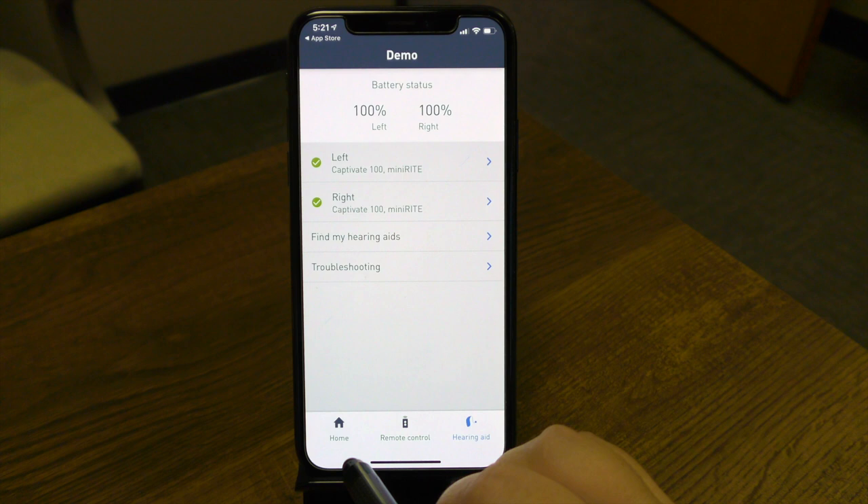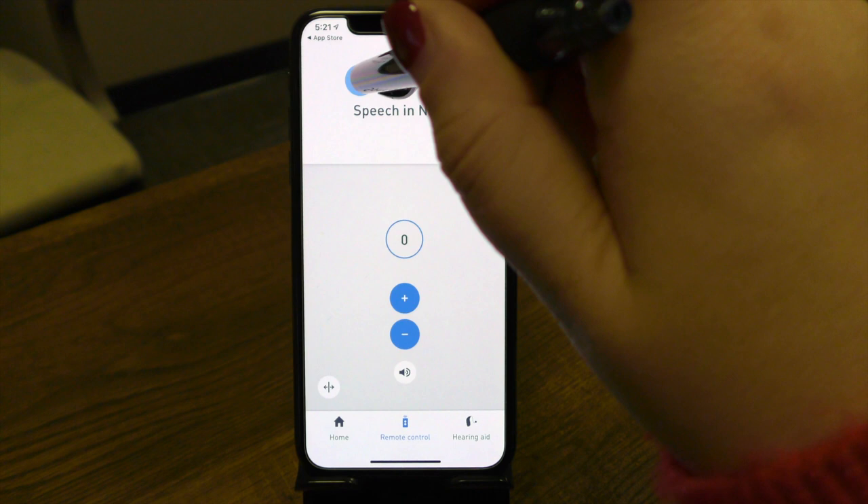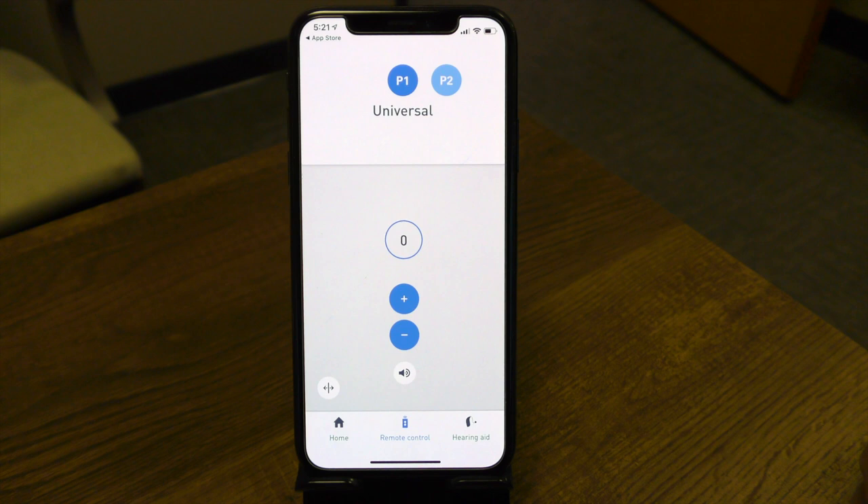To get back to your main dashboard, you can hit the home button, but I'm going to go back to the remote control — again, because this is where we'll spend the majority of time making changes if needed. I'll come back to my first program since it's more designed for an everyday situation, hence why it's called universal. So from here, we've really gone through the app: how to increase volume, decrease volume, and if you need to check battery power, you can come to the bottom right button of the app. If you have any additional questions on the app or the function of your hearing aids, please don't hesitate to contact the office and we're happy to walk you through that.